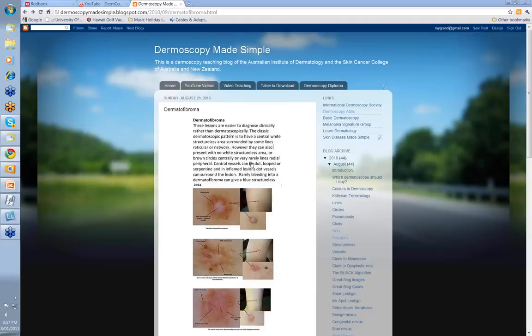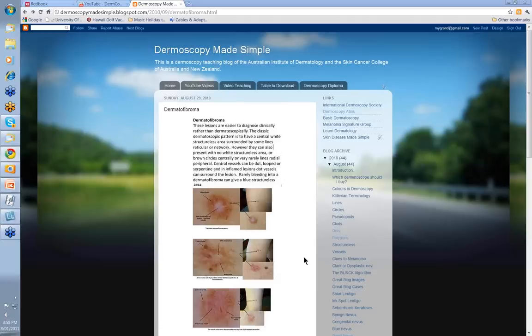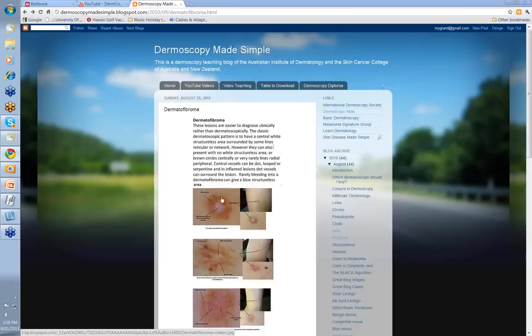They can have a whole variety of dermatoscopic patterns, and I'll show you some of these as we go on. But the classic one is to have a central white structureless area surrounded by lines reticular. However, they can also present with no white structureless area, or they can have brown circles centrally, or very rarely even lines radial peripheral.